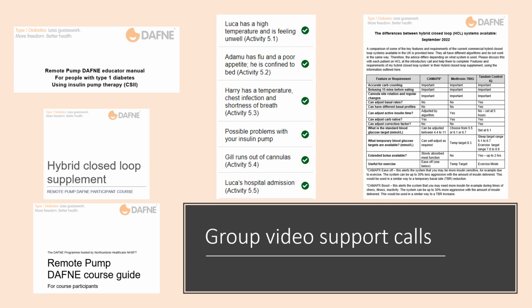The timetable, participant tasks, lesson plans and online activities for each week are in the Remote Pump DAFNE Educator Manual, as discussed previously. Useful guides to refer to in the call are in the course guide for participants. The Hybrid Closed Loop supplement contains information for hybrid closed loop users. The document Differences between hybrid closed loop systems available is used as a reference for educators in the introductory call to clarify the features of participants' hybrid closed loop systems so that they can record them in their hybrid closed loop supplement as part of the introductory call.